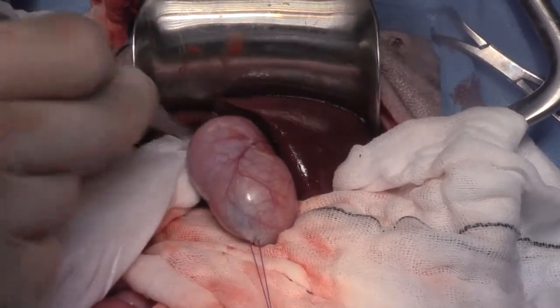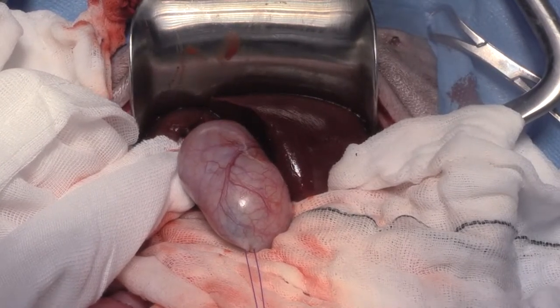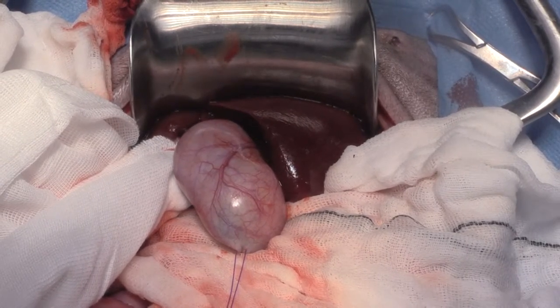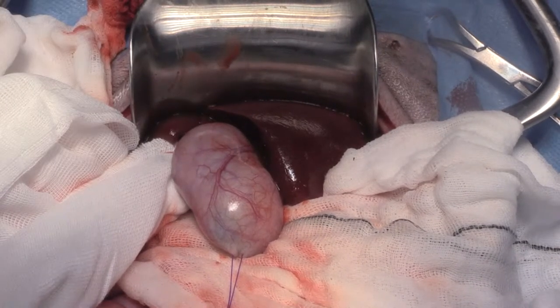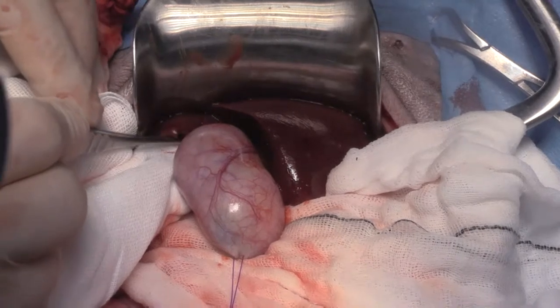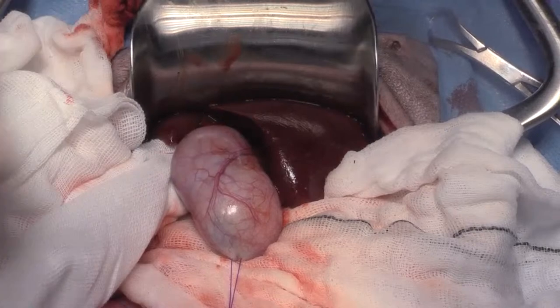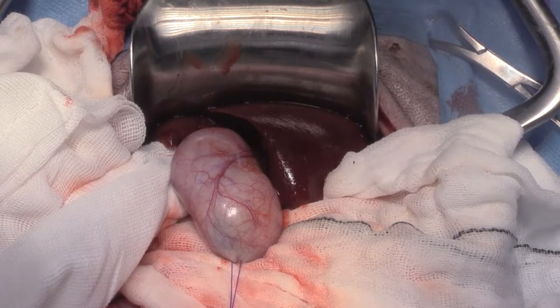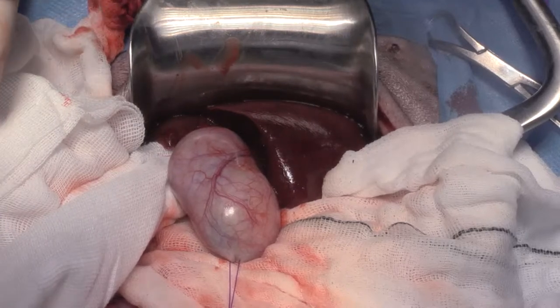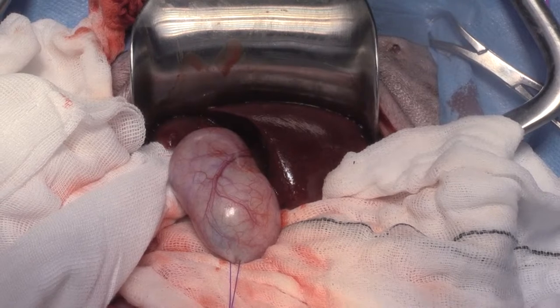Working down a pretty deep hole here, so I'm not sure how much you're going to be able to see on the screen, but we can see our gallbladder has kind of come out there. And once we've freed it off the attachments from the liver, which were up in here and just around over this side, the gallbladder does shift into a more caudal location, and we can get better access to it to put some ligatures on there. So different ways to do this, I like to just use a silk hand tie ligature. So can I get some silk, please, Cara?